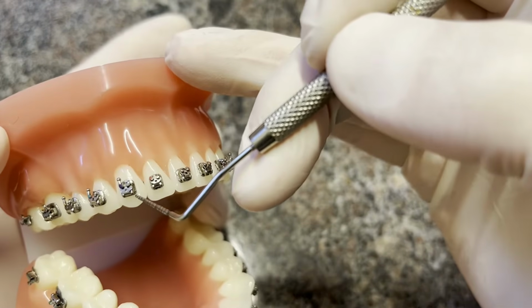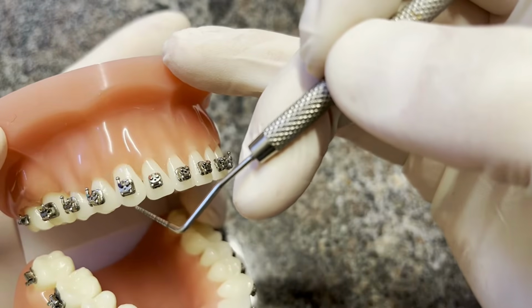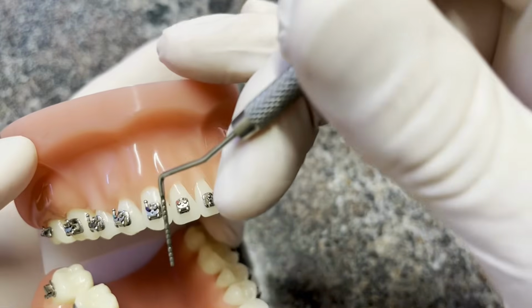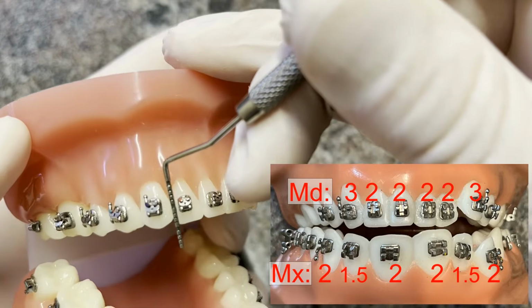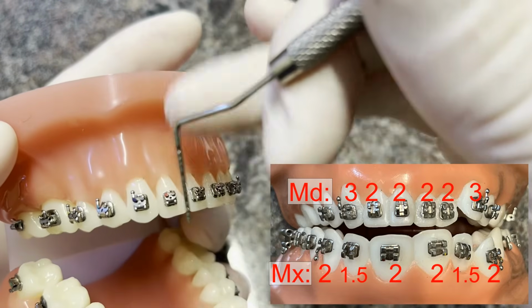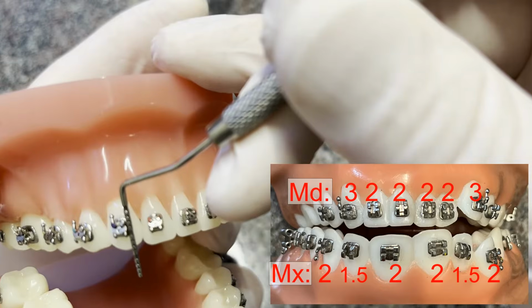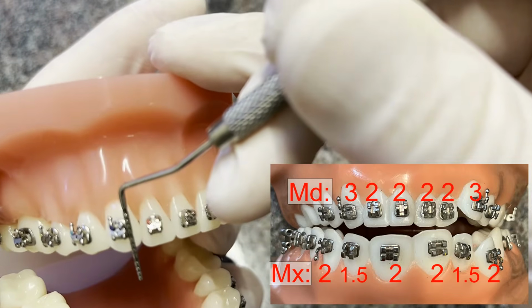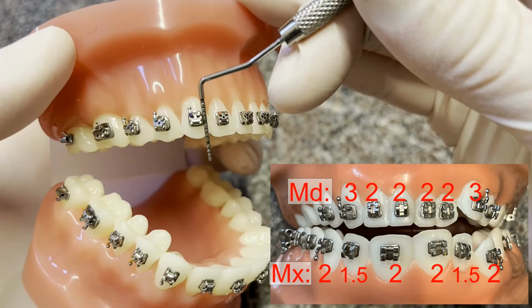Height-wise, I set from the edge of this bracket, the base of the bracket, to the incisal edge, about 3 millimeters. So I'll measure like this, from the bottom of that large black line, and then I'll eyeball about 3 millimeters. So this one's not too far off. So I'll look at it kind of like that.